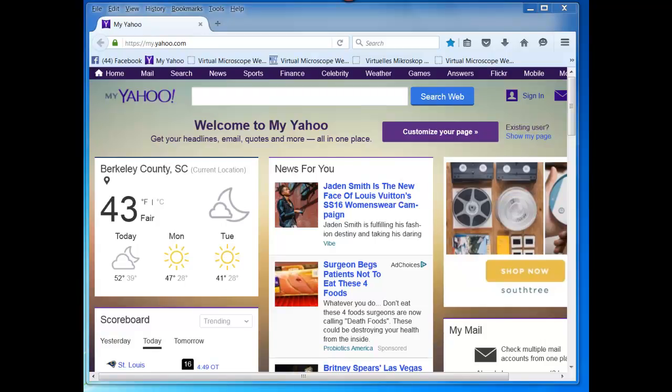This video will demonstrate where to get the Biolucida Viewer installation file, the steps in installing it, and setting up two clouds. One is to view lab specimens, in addition to the ones you study in WebMic, to get a further feel for the more realistic histology and virtual slides.